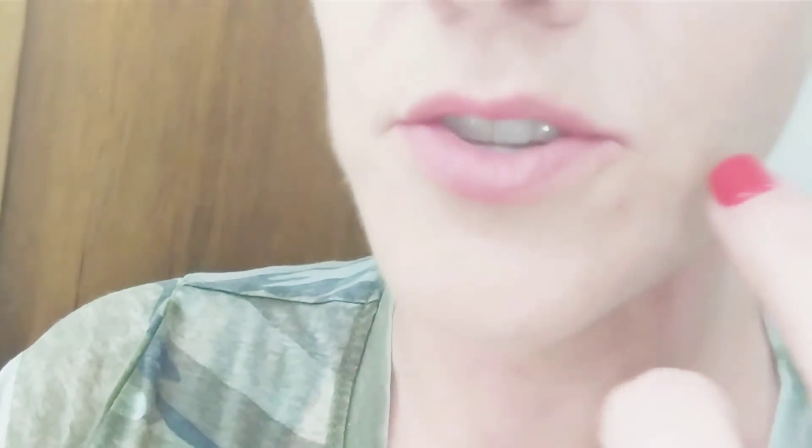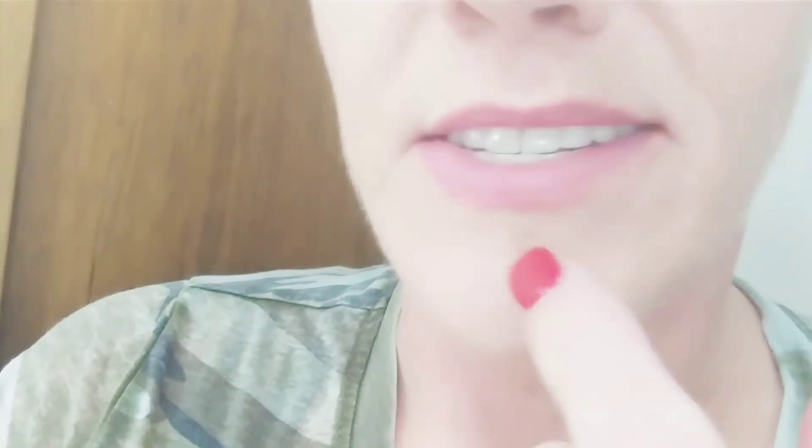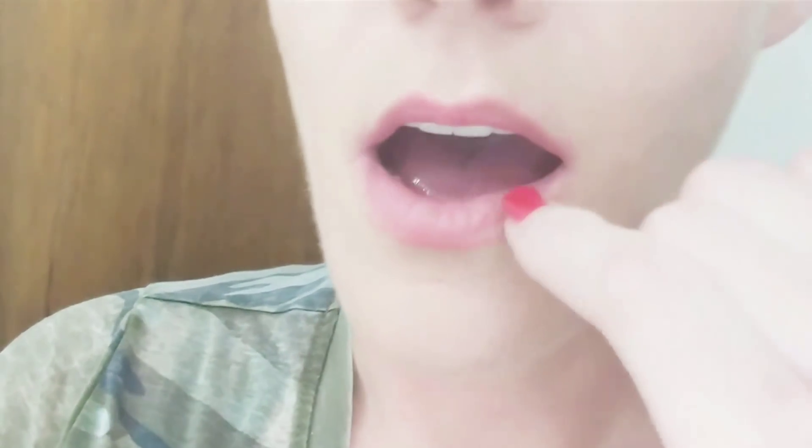I want to get up close and personal with my bottom denture. The second part of this video is going to be me applying my denture liner comfort lining on the lower. I figured I'd make a video today on how to apply it on the lower denture even though there are other similar videos out there, but all these videos help.